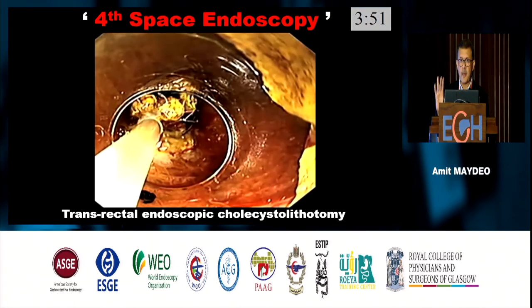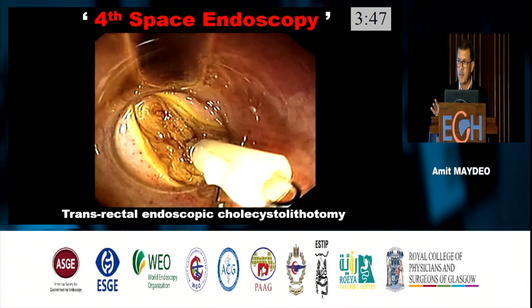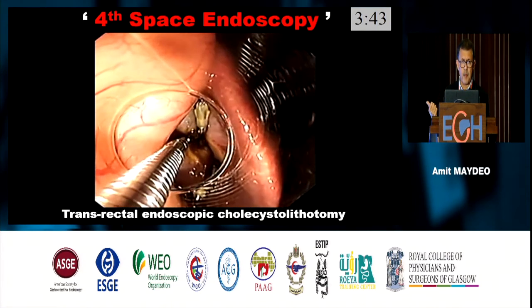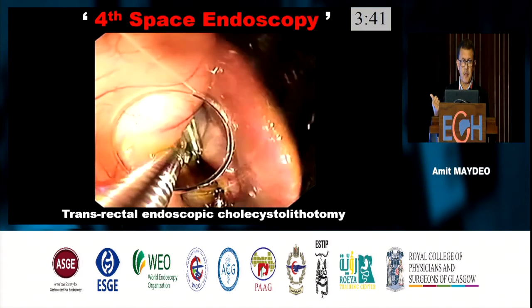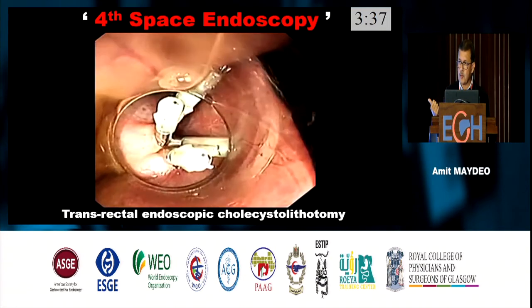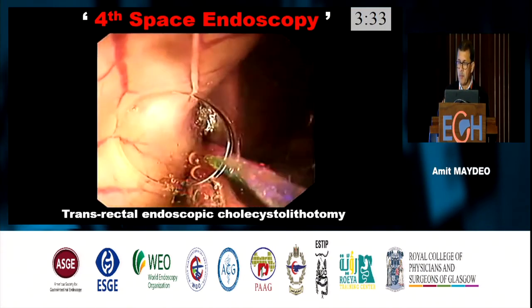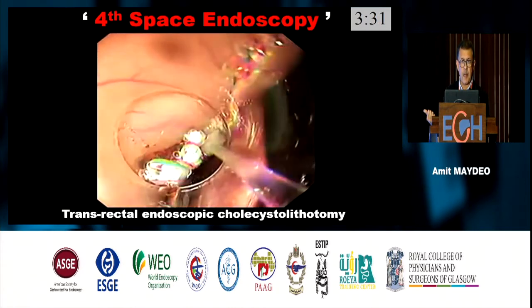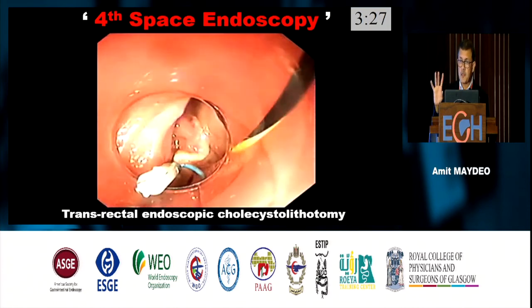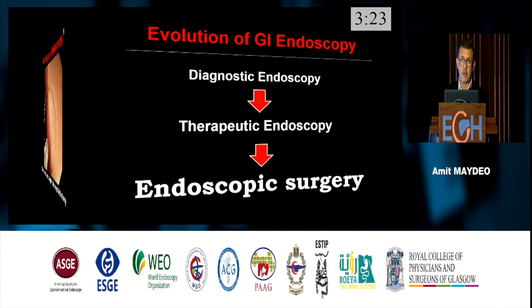This is against traditional thinking. This is against traditional teaching. However, let me tell you, this was a procedure we did 4 years back. Till now, this patient is completely asymptomatic. All that we did was only removal of gallstones. He had a functioning gallbladder, and the pain completely went away. The patient never developed another attack of cholecystitis, and these clips did not give any trouble. So this is thinking not only out of the box, but thinking as if there is no box.